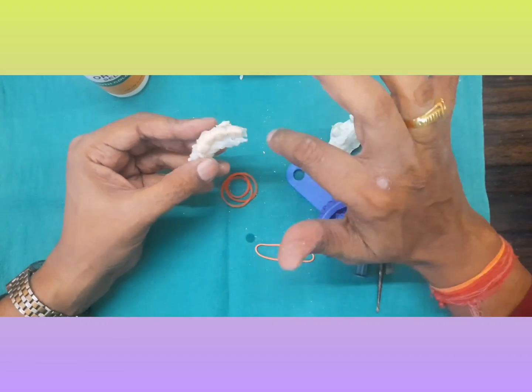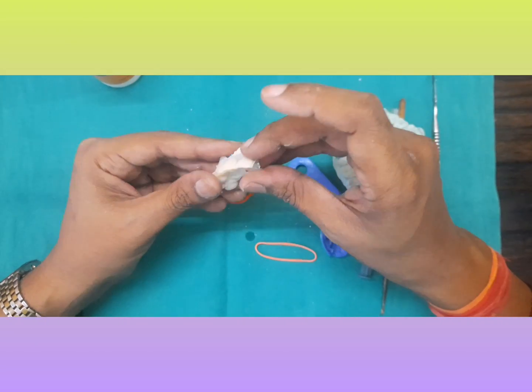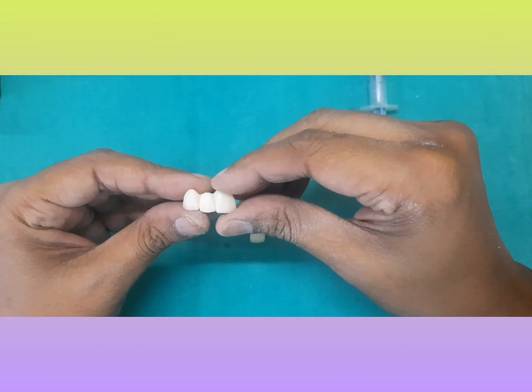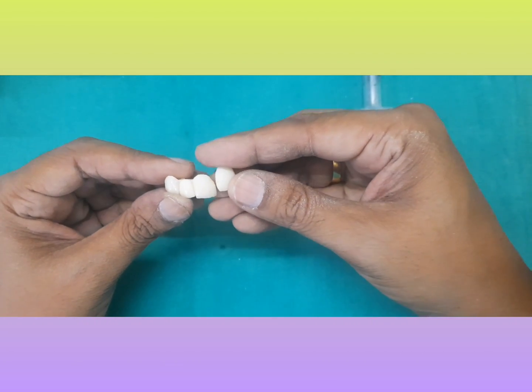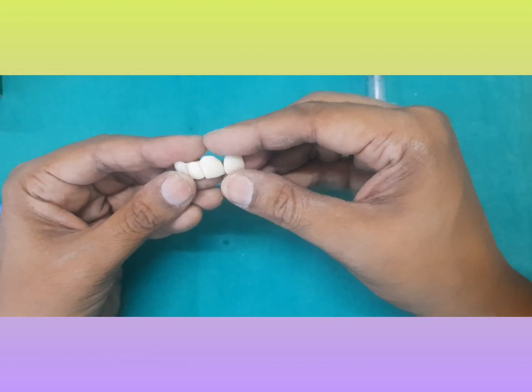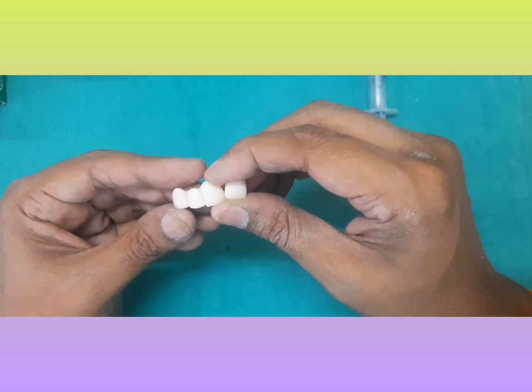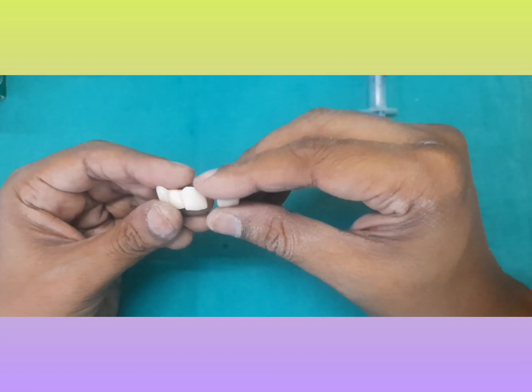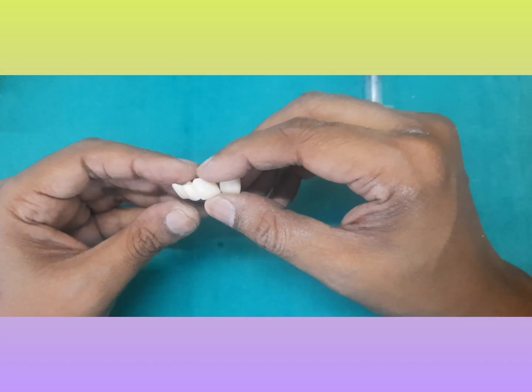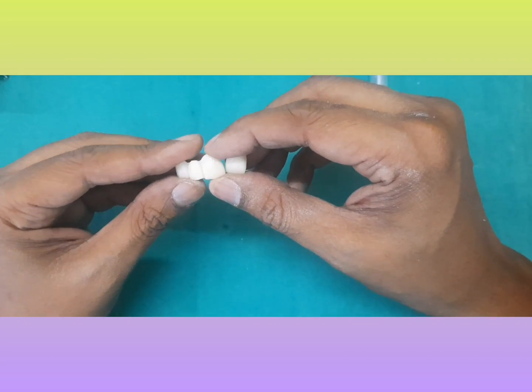Now what I will be doing is finishing and polishing this, and then we can insert it in the patient's mouth. Once we have removed the flash, finished and polished, it is ready for cementation on the prepared surface of the tooth. You have to use temporary luting cement — like zinc oxide eugenol — for cementing these temporary restorations. These are only for some time, so they should not be bonded with any permanent luting cement, as it becomes very difficult to remove and you can damage the prepared tooth.